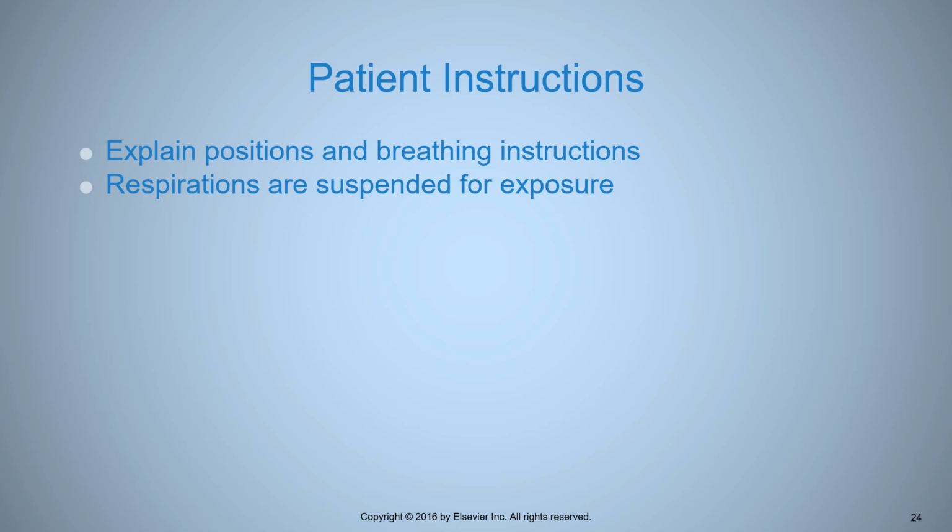Okay, if you have pediatric patients, you can't use AECs, so when dialing up a manual technique on a pediatric pelvis or hip, make sure you increase your mA station to something radical like 400 or 500, and that'll allow you to dial up the smallest exposure time possible to try to prevent motion. Remember from your physics class, the velocity formula is dependent upon time. It's in the denominator. So if time doesn't pass, motion doesn't make sense. So that's why we want short exposure times.